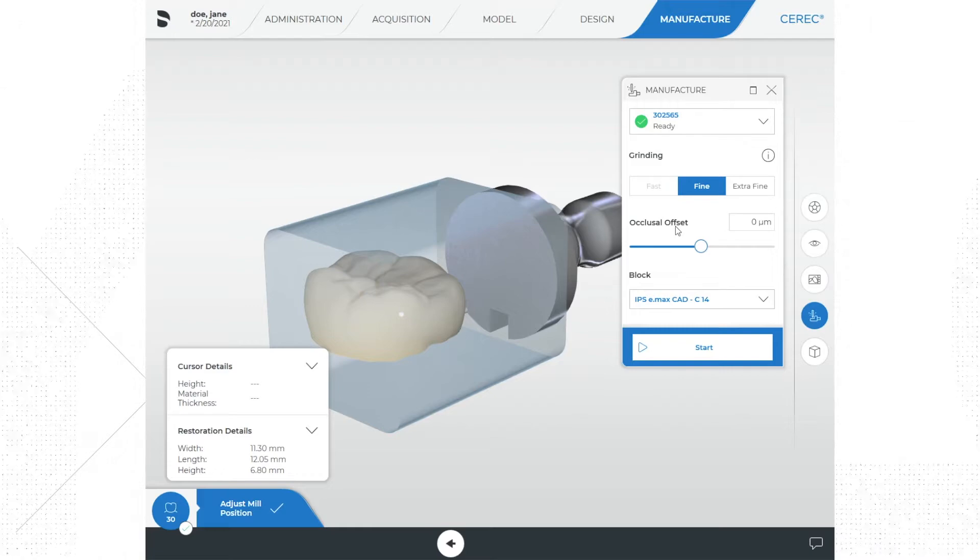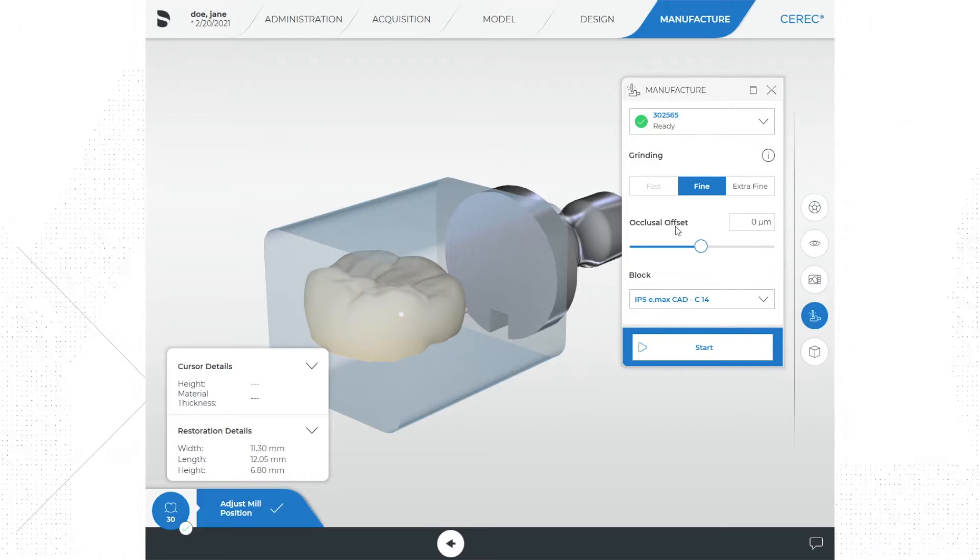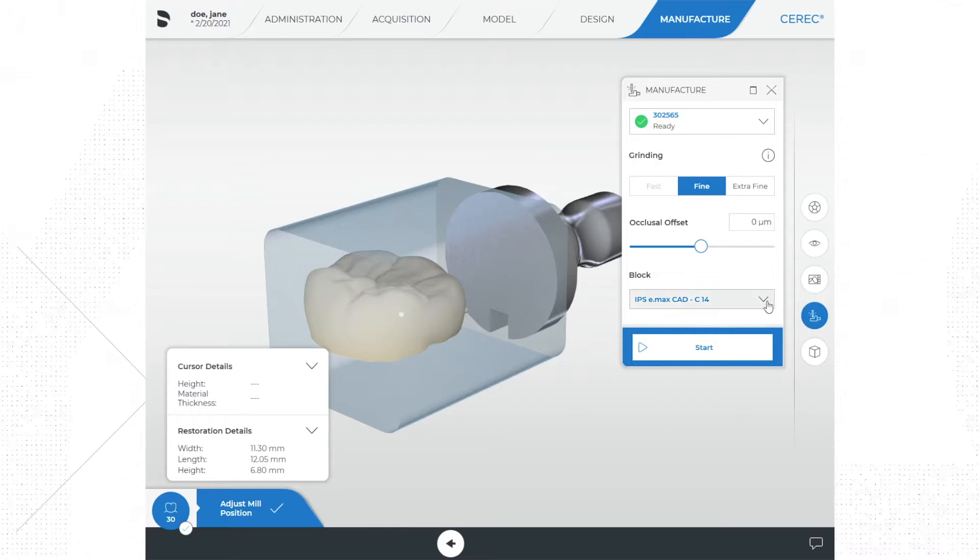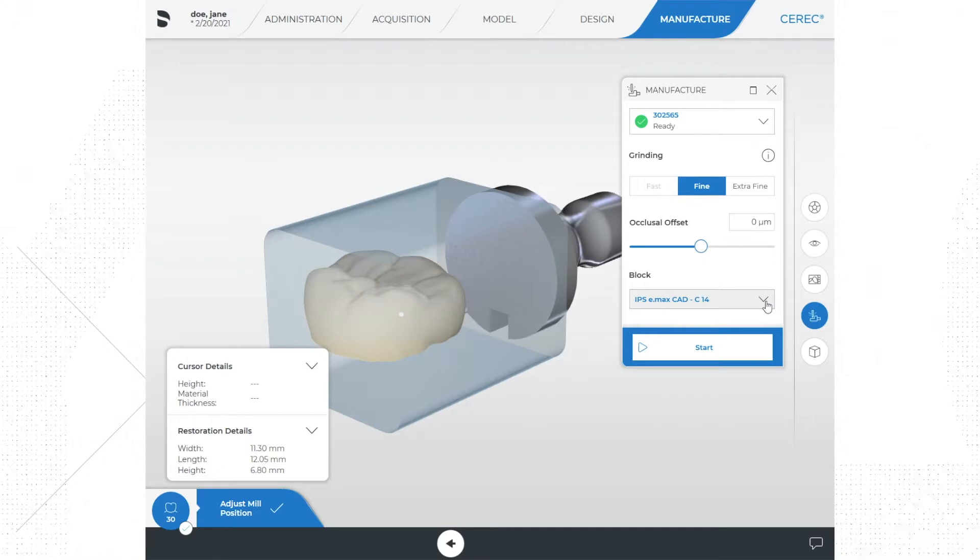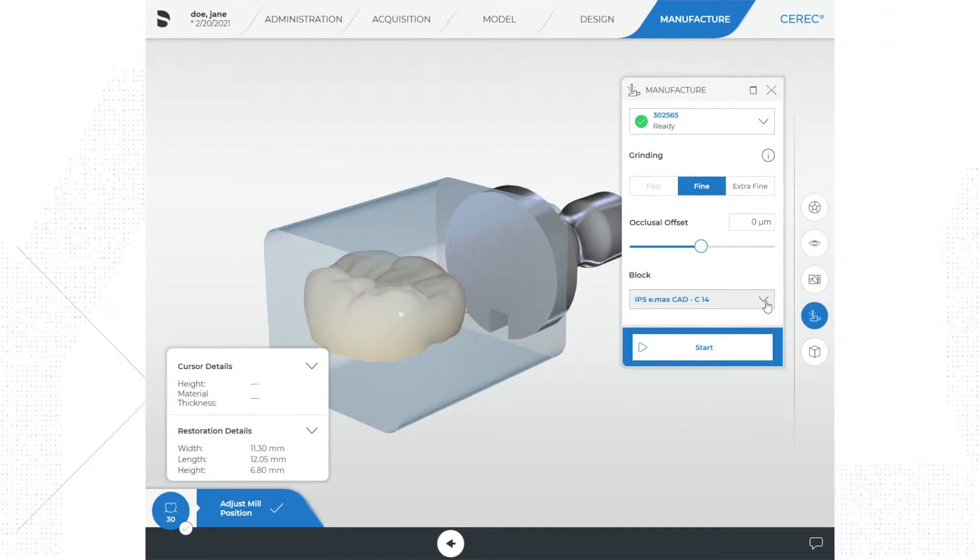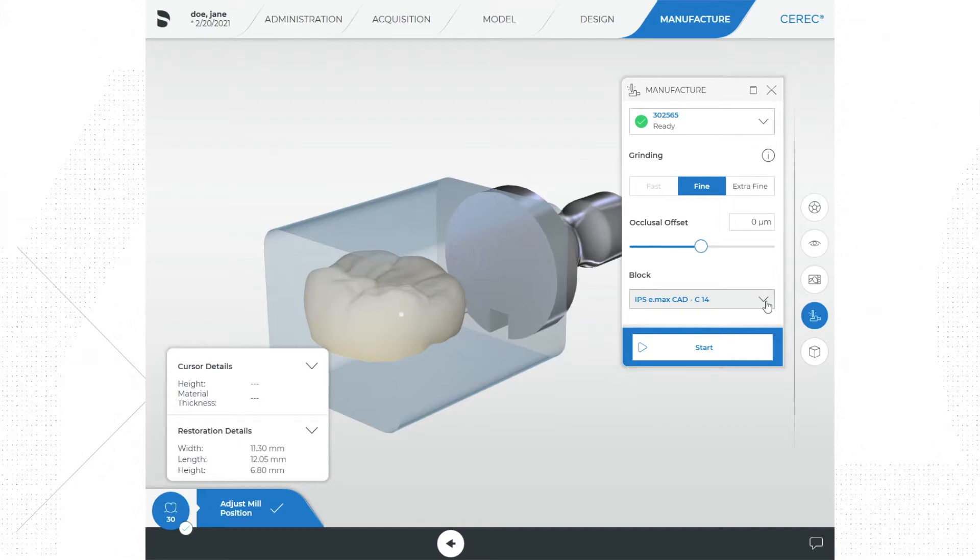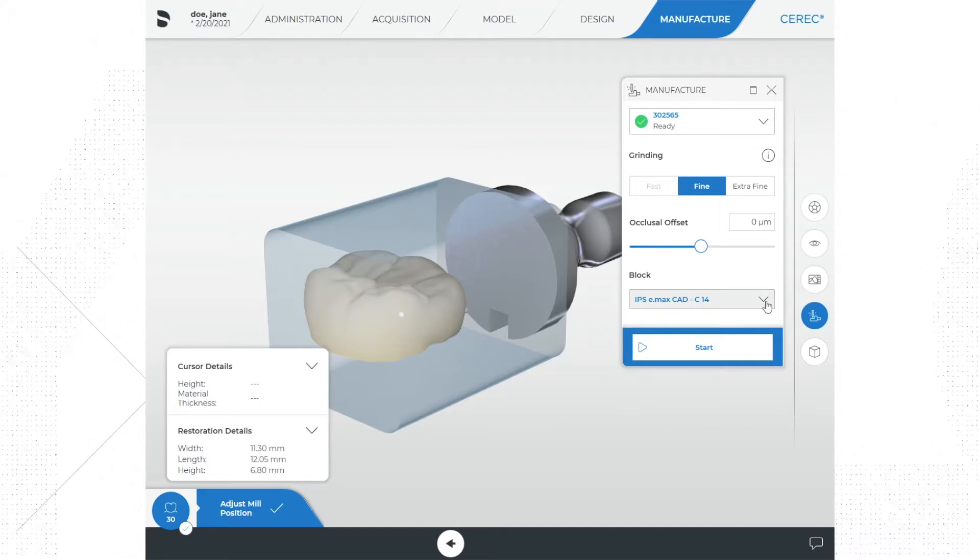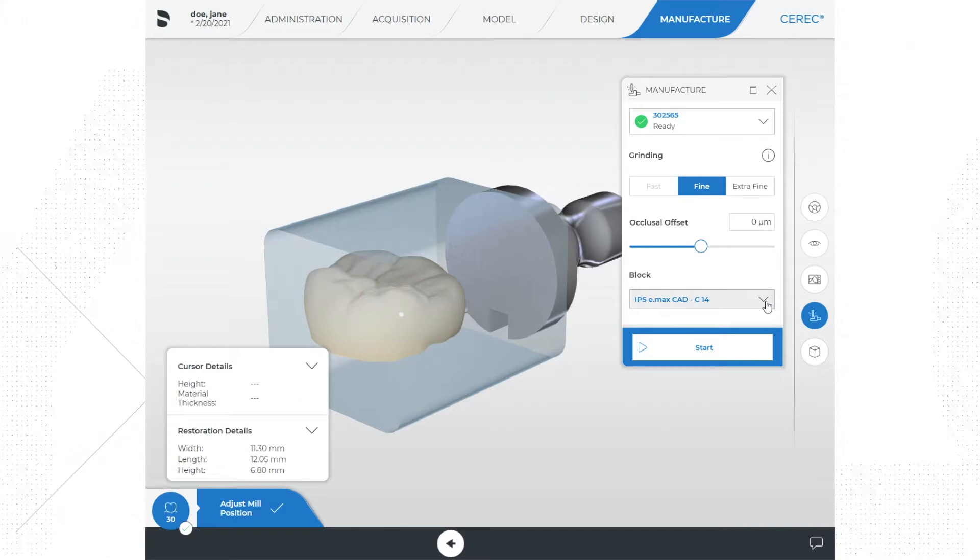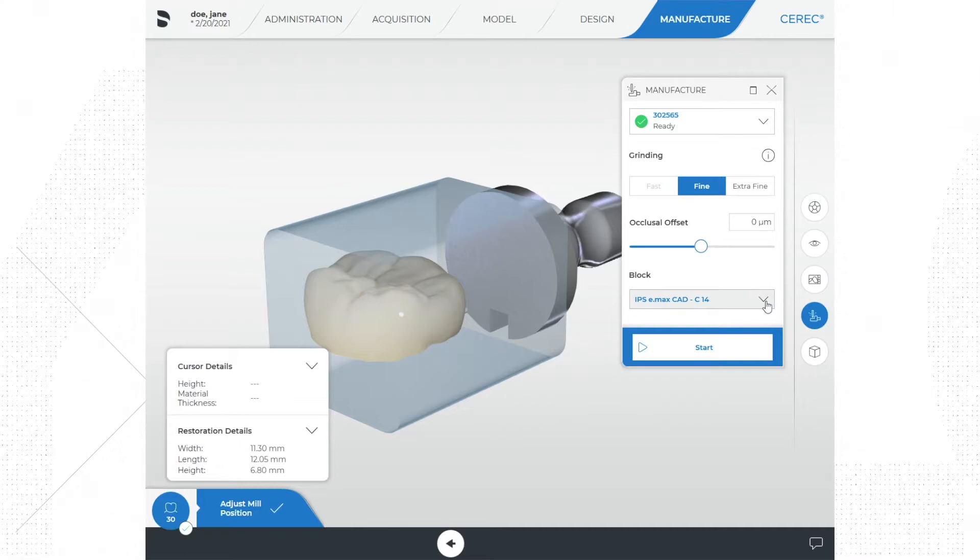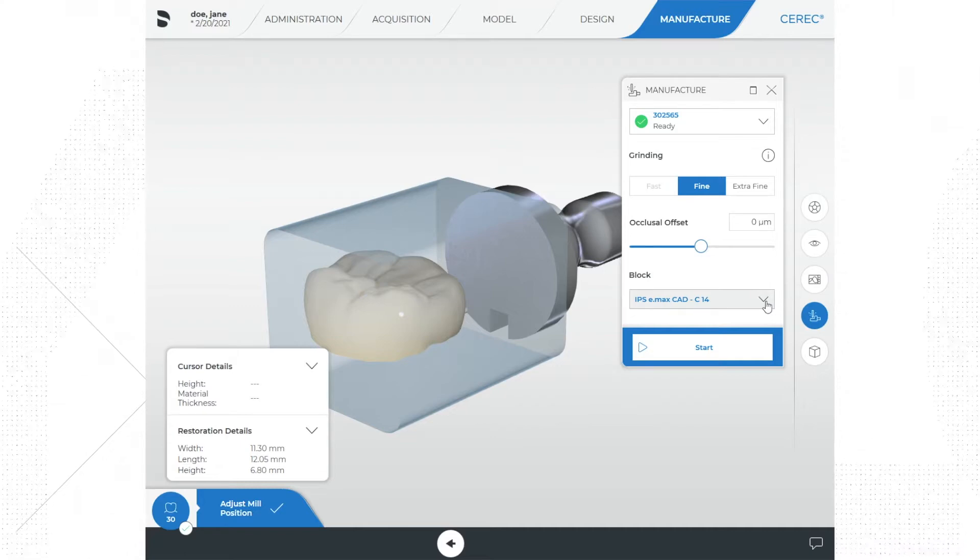Now the software will analyze the size of your restoration and will default to the smallest possible block that can accommodate your restoration. This is done on purpose and really is done to conserve block material. Why use a bigger block when a smaller block will suffice? This saves money. You will see that for this restoration the default block is an e.max CAD block size C14.